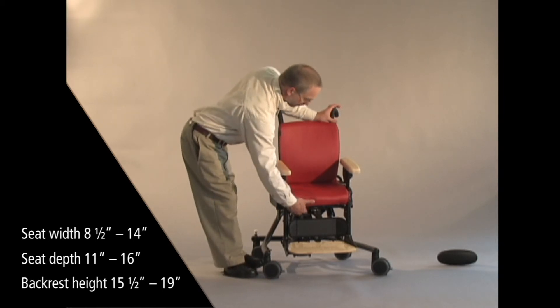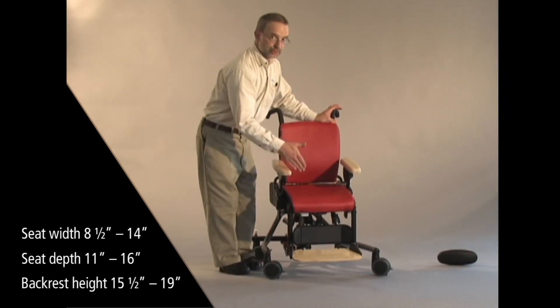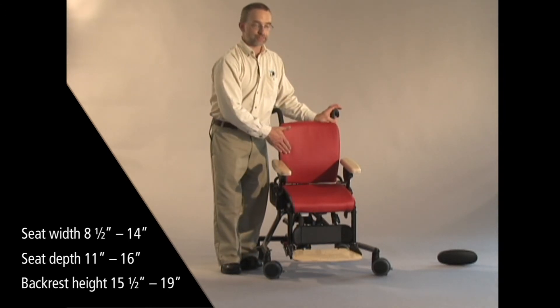Pulling the seat all the way out, we get to a full 16 inches of seat depth from the front of the seat to the back.